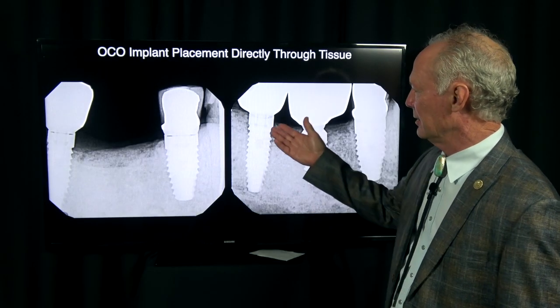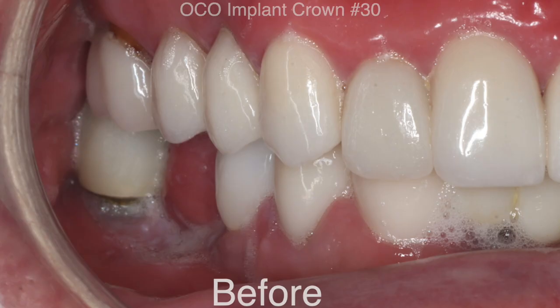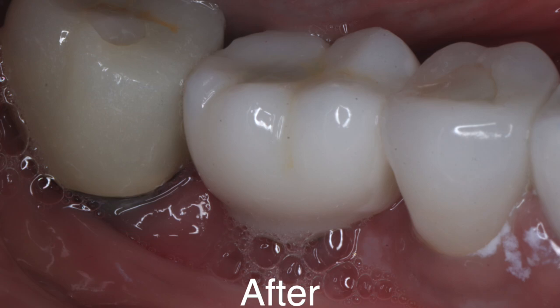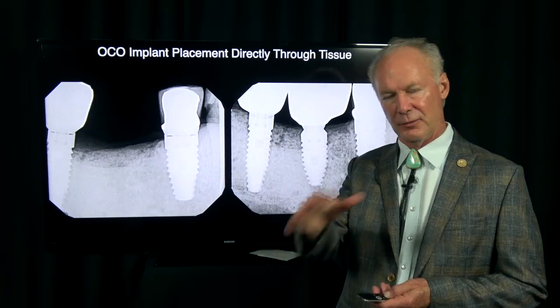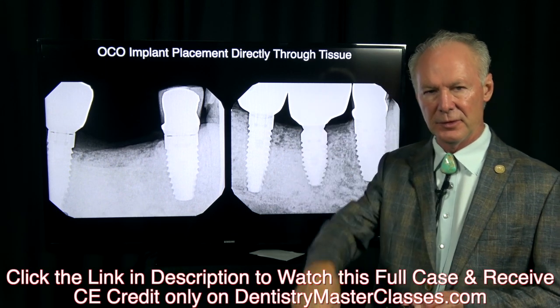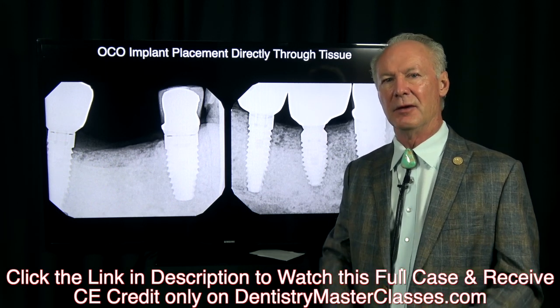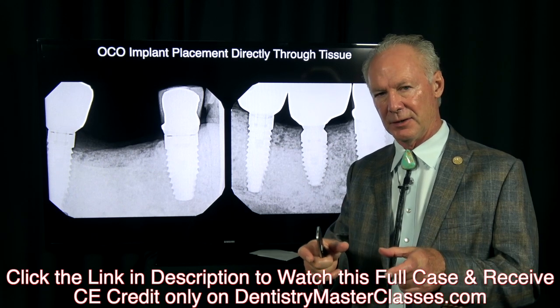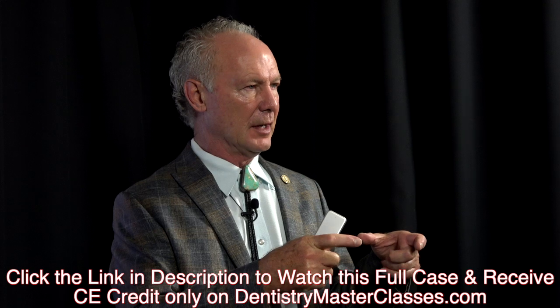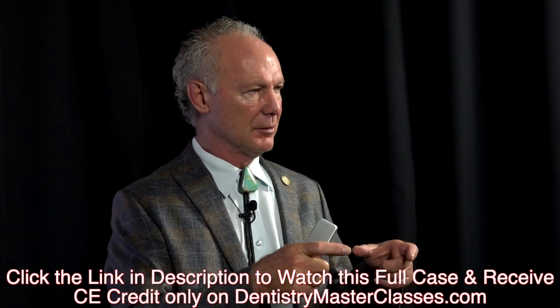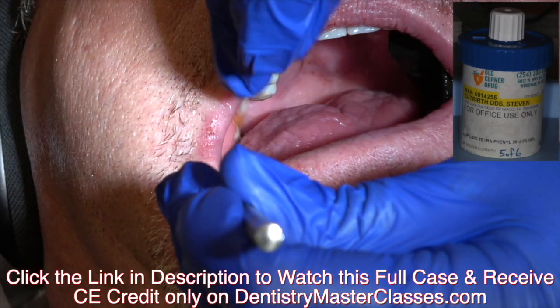In this video, I'm going to be demonstrating how to place an implant directly through the soft tissue. This is the OCO implant system. I really like it because it has shoulders on the drills. A lot of people like to reflect a flap if you have an edentulous area and place the implant with the flap reflected. I prefer to go through the soft tissue because when you place the healing abutment on the implant, the emergence profile of the soft tissue forms around the healing abutment while the implant is osseointegrating for three months.